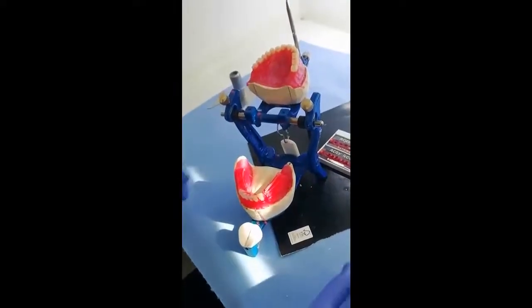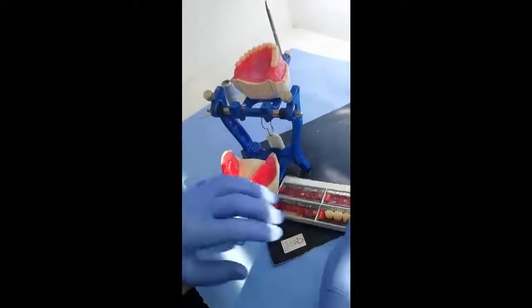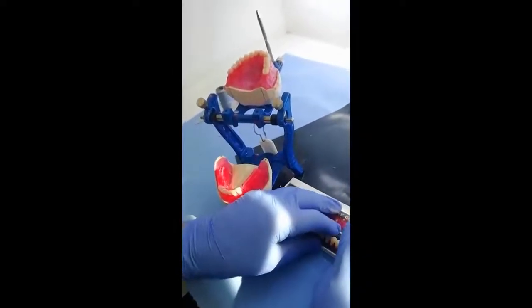Now, we start setting the mandibular teeth with the first molar.